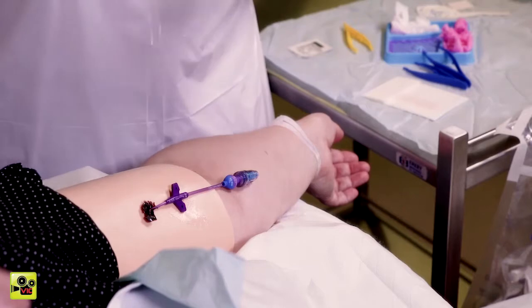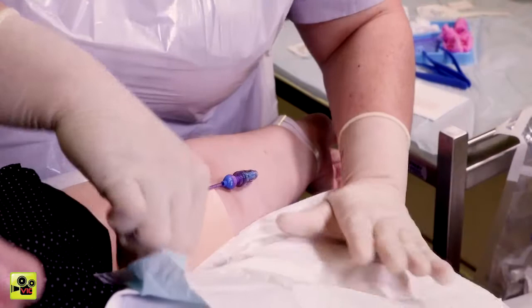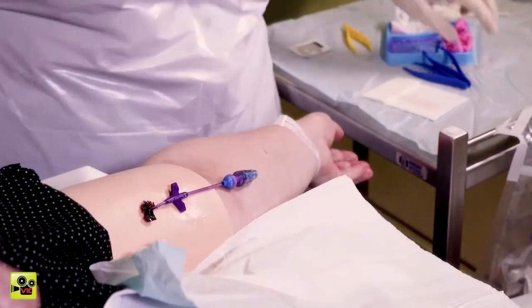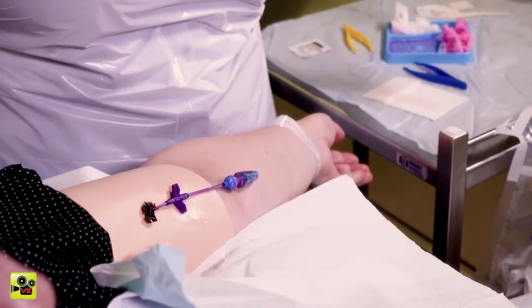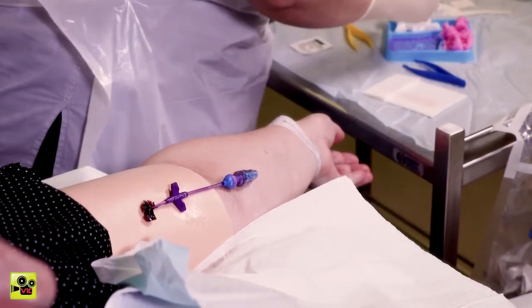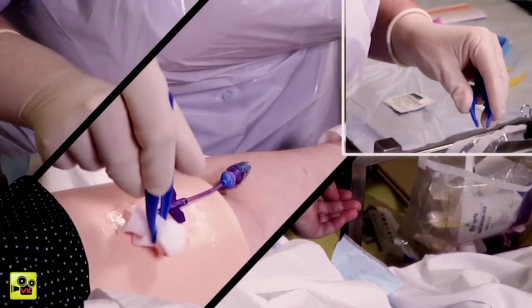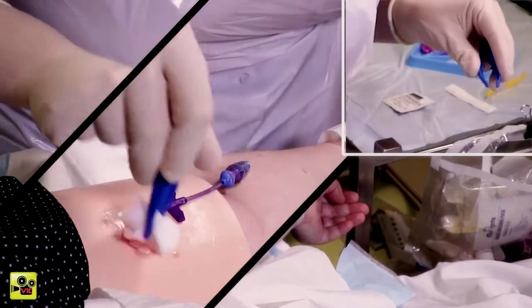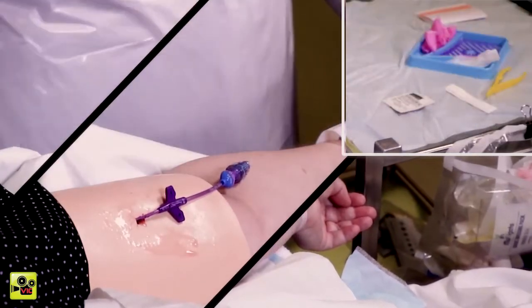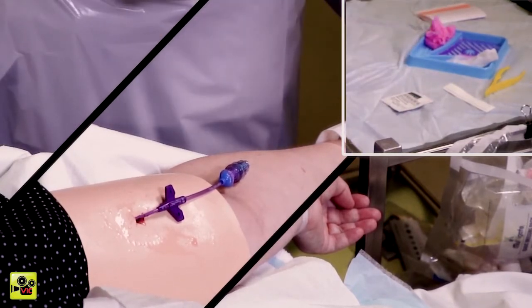I'm just going to put this little towel here, Vic. You're staying still, and that's lovely. Just stay nice and still for me, okay? So I'm just going to start cleaning with the solution now. It can be a little bit cold, but there's just a little bit of dried blood there, so I just want to get that off. Yeah, that's good. It's a bit cold, but it doesn't hurt. Does that feel okay? Yeah, that's good.